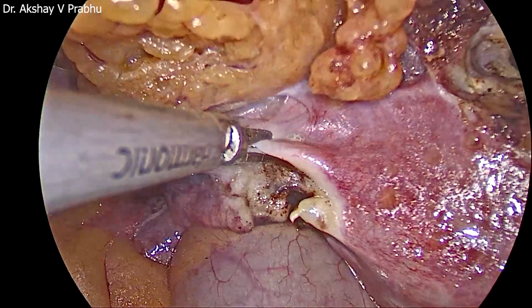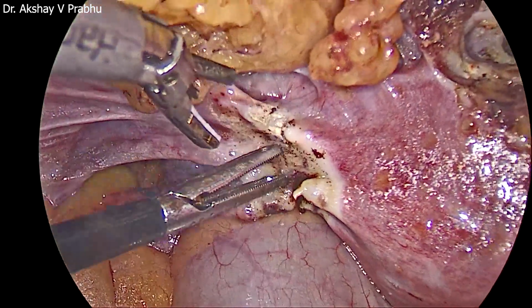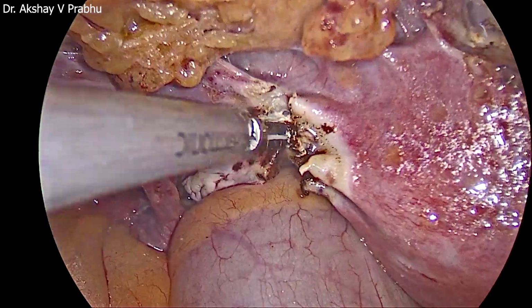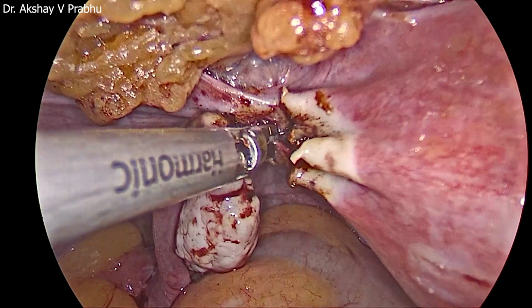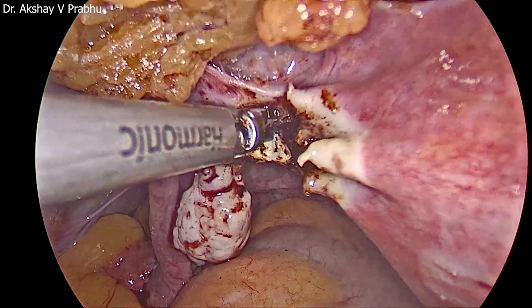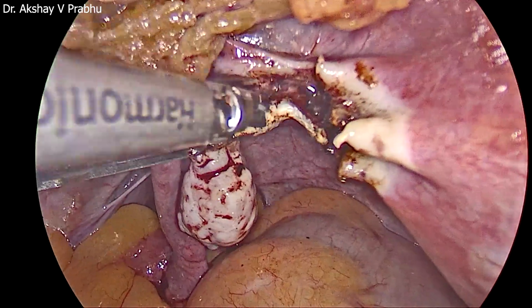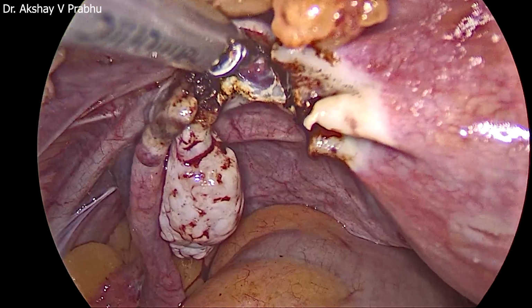Now back to the left side, I'm tackling the round ligament which I had left, in the hope of opening up the broad ligament and getting a space, trying to get below the urinary bladder, or at least to locate the uterine artery, because once you locate the uterine artery, things become easier, as the bladder always lies anterior to the uterine artery. Whatever complicated the anatomy, this rule does not change. The bladder will always lie anterior to the uterine artery. But in these cases, it's tough to locate the uterine artery. So I'm exactly trying to do that.